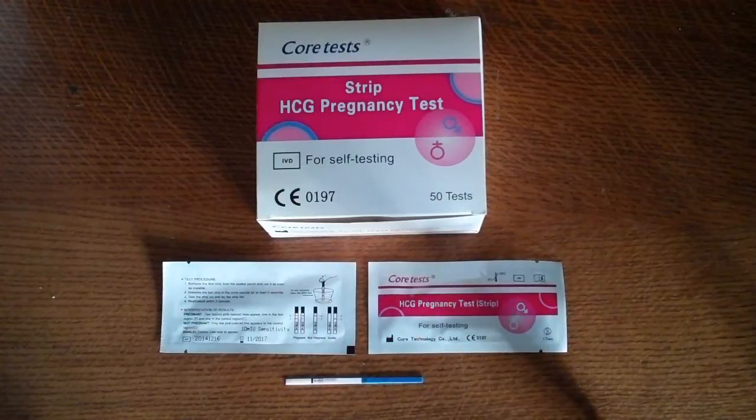Now, some manufacturers are claiming that their test will work up to 5 days before a standard test. Many others relate this to days before the missed period, either 5 or a maximum of 7. We think this is a little misleading because in those instances, to claim those statistics, you are only detecting between 5 and 10% of pregnancies at that early stage. But what they will do is detect pregnancy earlier than the standard 25 MIU test, which will only become positive in the 24 to 48 hour period after a first positive on a 10 MIU test.